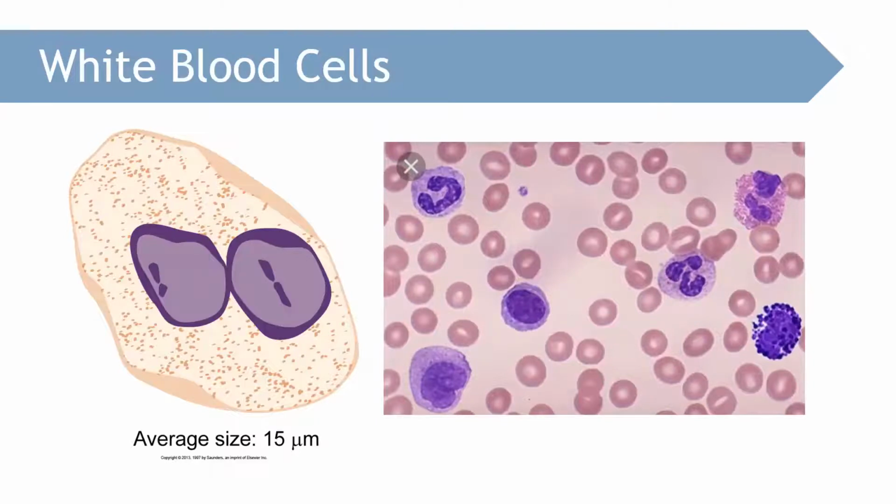To start with, we have white blood cells, which are often mistaken as amoebic cysts. In a patient suffering from amoebic colitis, ulcerative colitis, intestinal dysentery, or intestinal amoebiasis, WBCs may be misidentified as amoeba cysts, right?